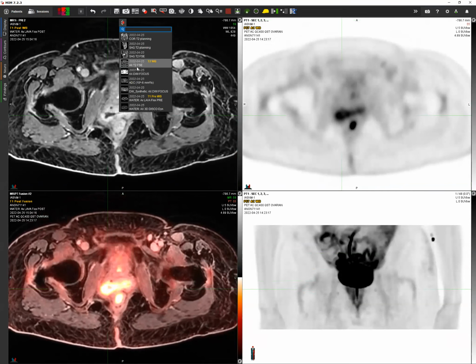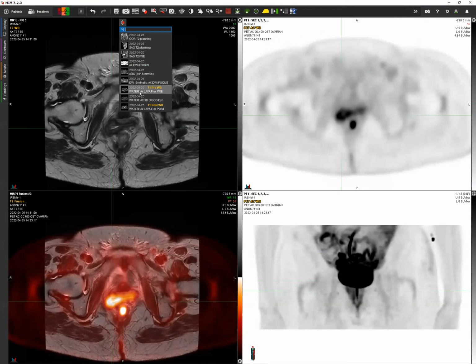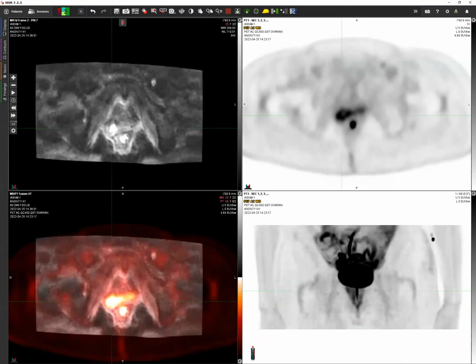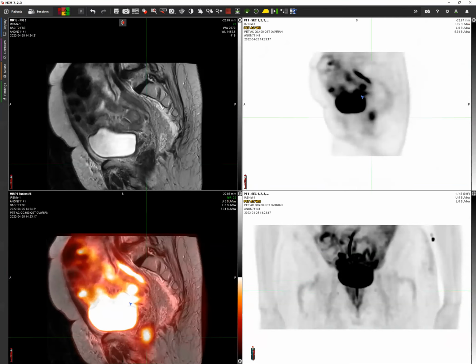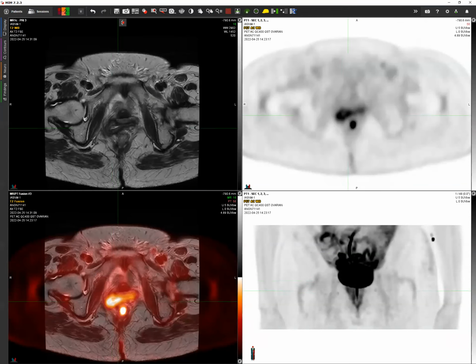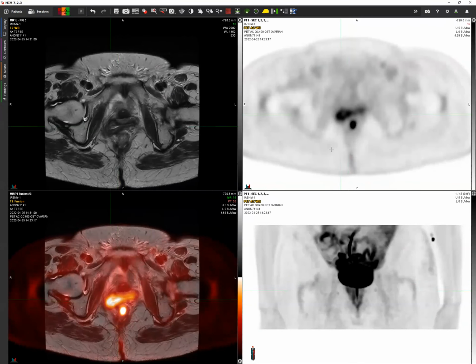Right. So the nice thing is when you're interpreting the MRs for the diagnostic rads or for anyone else that is dual certified, it's actually quite nice to see how well it fuses. You can then switch things around if you're interrogating a lesion without having to re-find the lesion again on the next image sequence. Everything is pre-fused. So that's actually really nice, and it gives us better interpretations, honestly.